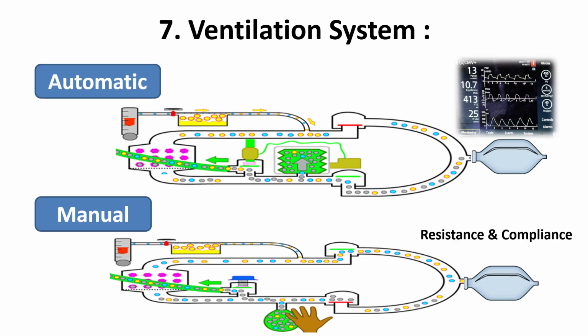And finally, which all of us do as if we have already done the whole previous anesthesia machine checking, and consider this the sole checking method for the machine, is the ventilation system. We connect the bag with the ventilator and check the controlled and manual ventilation. This is the last step, not the whole checking of the anesthesia machine.